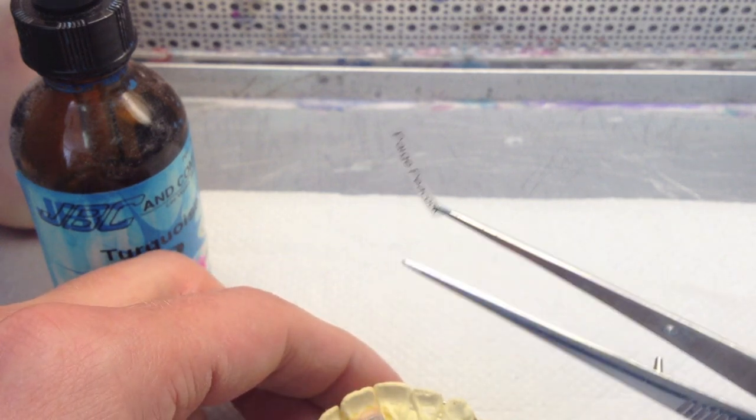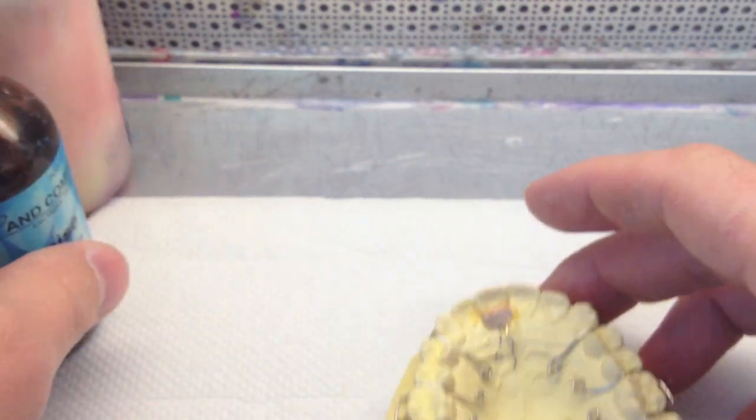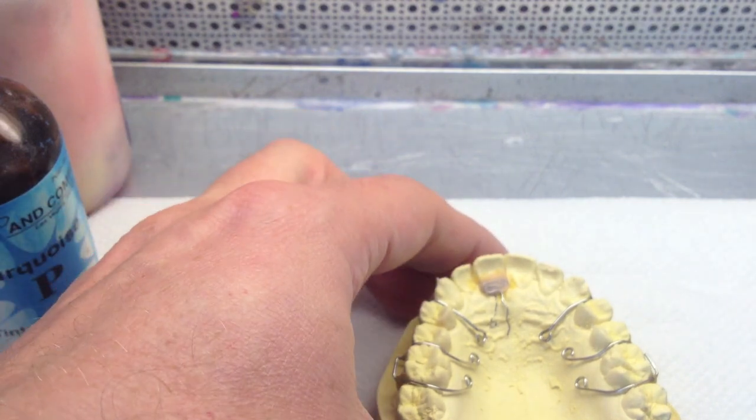I'll be putting a name in. In the state of Texas, you have to put a name in your retainers — all the removable appliance ones.